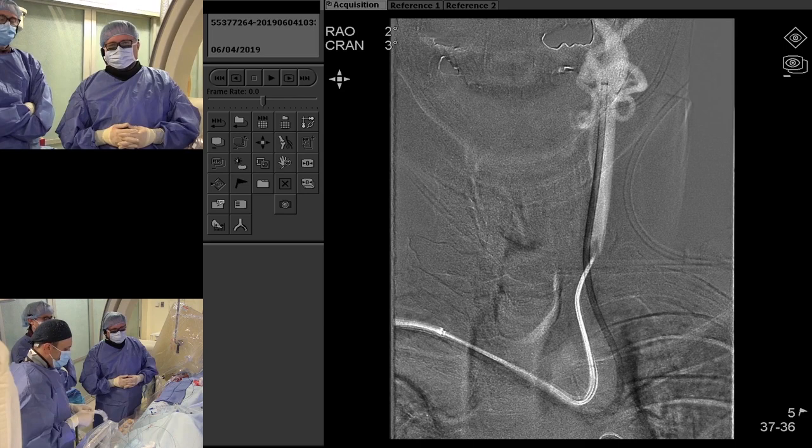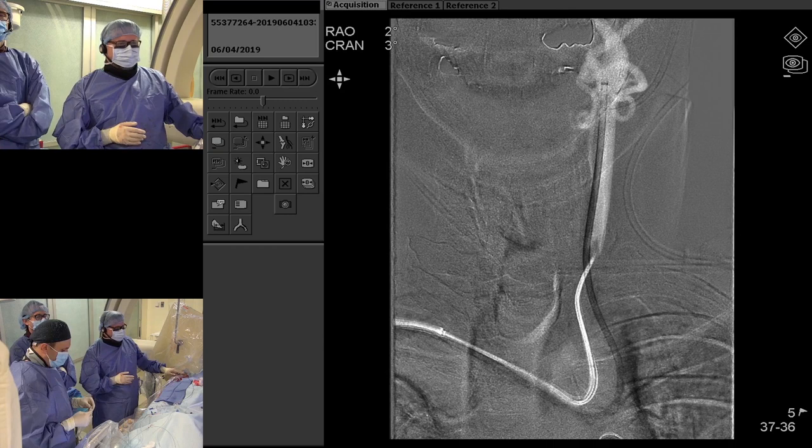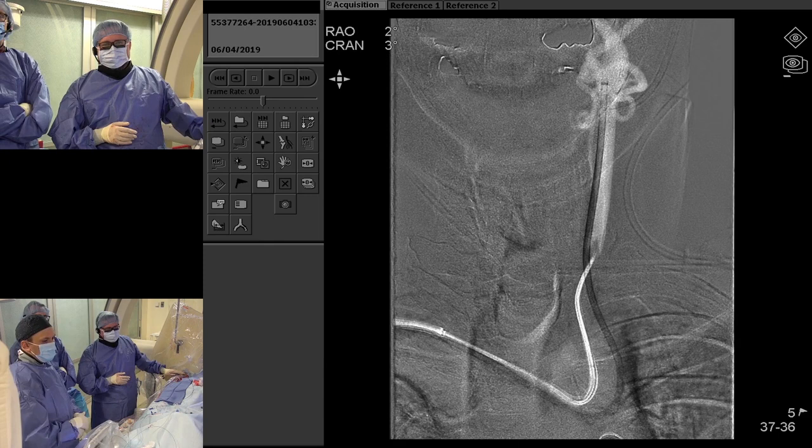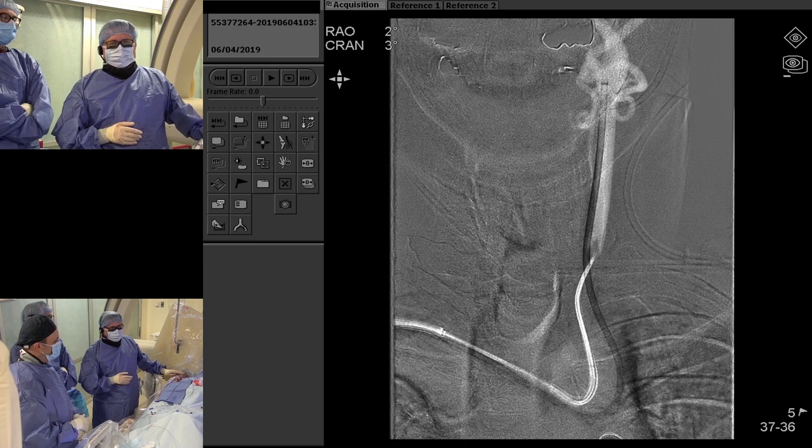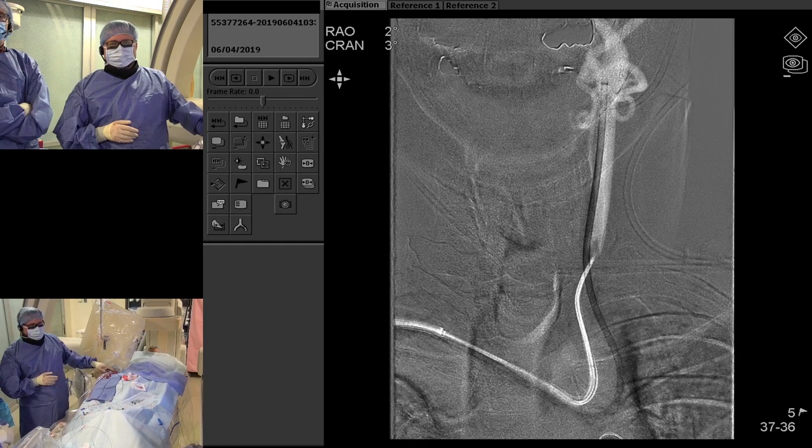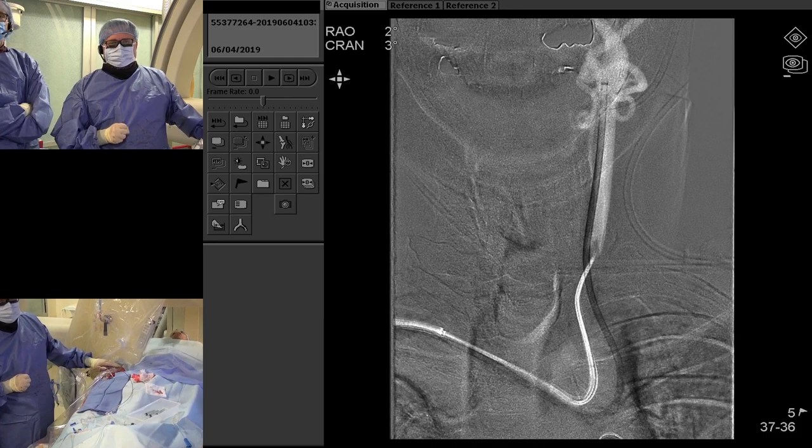If you take a shot of the wrist, what you're going to see is the Neuron Max is in as its own sheath — it is a sheath-type device. We do not have another sheath around it. So this way we have eight-french access but with the equivalent of having a six-french sheath. In a sense, you're using it as a sheathless guide catheter. That is correct.